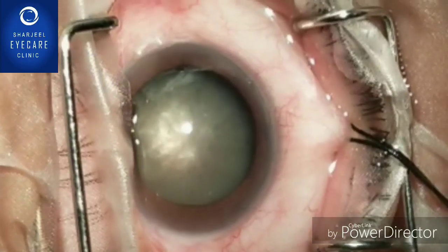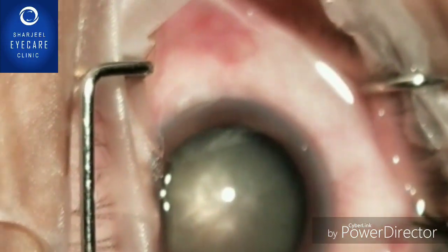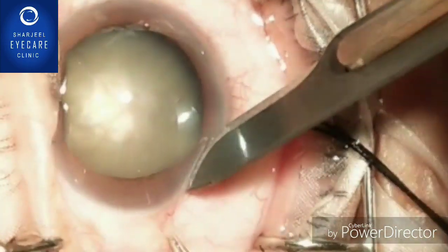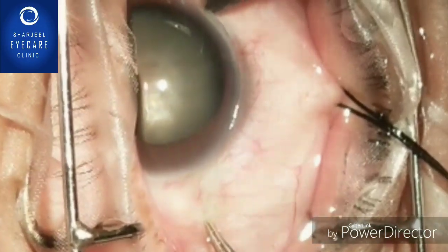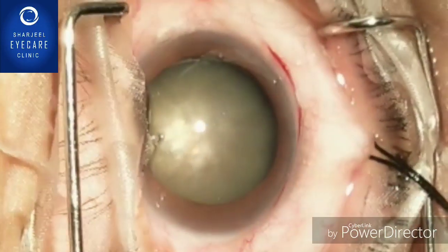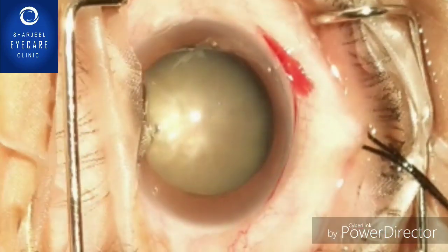After applying retrobulbar block and bridle suture to fix the position, we are giving a partial thickness incision with the 15 number blade. You can see superior subluxation — it is almost 180 degrees.